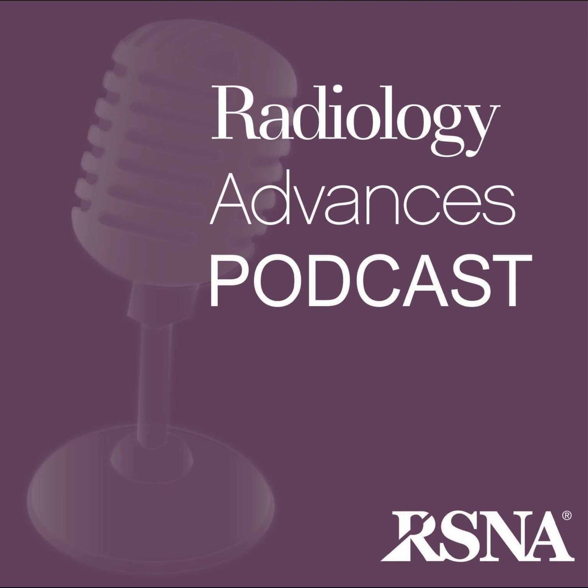Given that MRI-PDFF is considered the non-invasive reference standard, how do these UDFF findings compare to what's been reported in other studies using MRI-PDFF post-bariatric surgery? Does the 11% post-surgery UDFF align with what has been shown with MRI-PDFF? That's an important comparison, and it's where we see some nuance. Other research reported a mean MRI-PDFF reduction from about 18% at baseline to 4.9% at 6 to 10 months post-surgery.